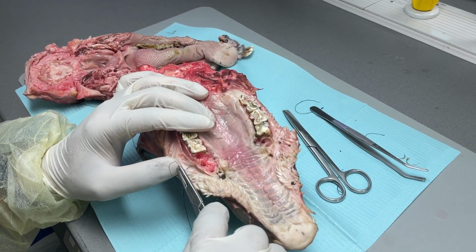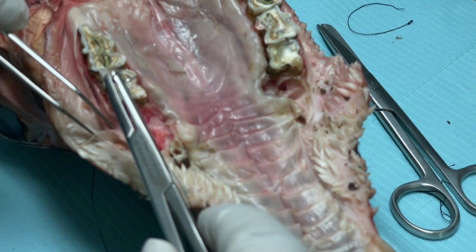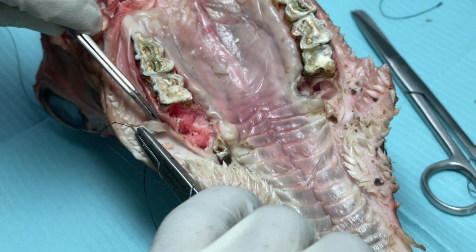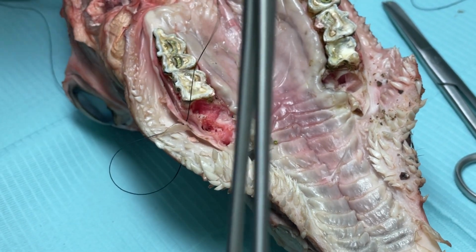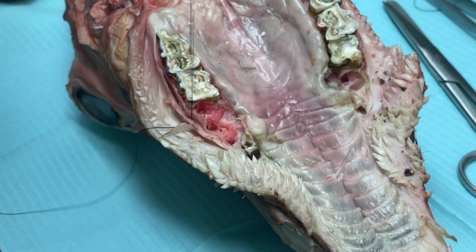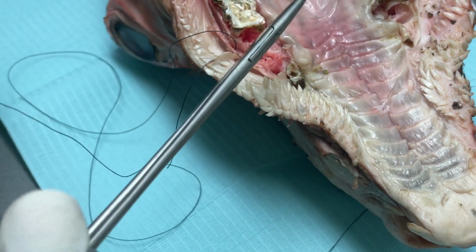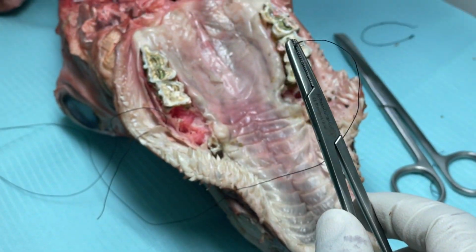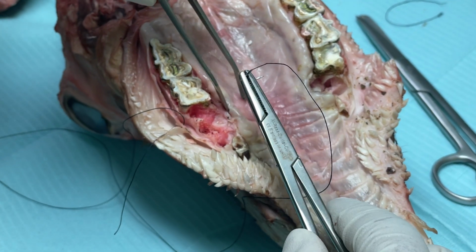So remember, making a square. Now I will enter from here, point 1. I'm coming from here, point 1. I am holding the other end so that it doesn't go anywhere. Then point 2, internal surface. It looks like it's simple interrupted. Yes, but then we go to the other.